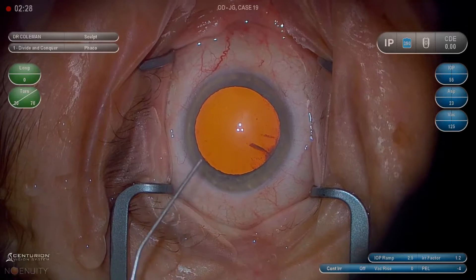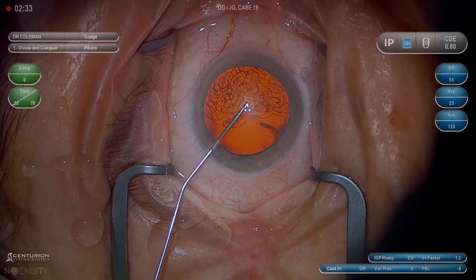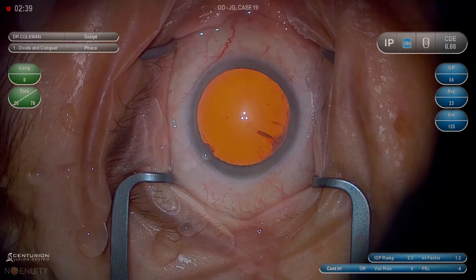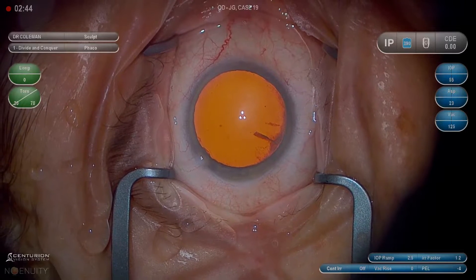Here is Viscoat. We'll come across the eye and then burp the lidocaine back out through the paracentesis. Try to get a complete fill, but the eye doesn't have to be too hard, just firm. We don't want to cause too much discomfort to the patient, but get it firm enough so we can make a good main wound.